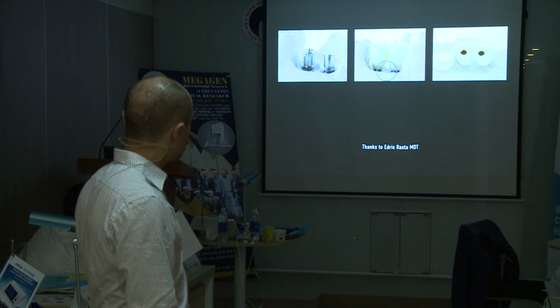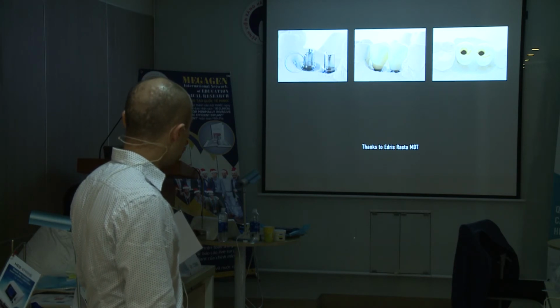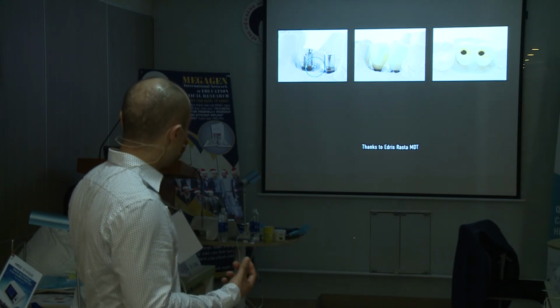And then it goes to the dental technician. Who knows what this is? This is the cast. This blue one is the lab analog. It's the implant that goes in the cast. What is this?